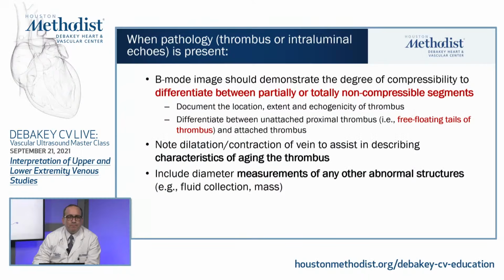Doesn't take forever, but the closer the compressions you perform, the more reliable your test, because you don't want to miss a focal thrombosis that may be present.